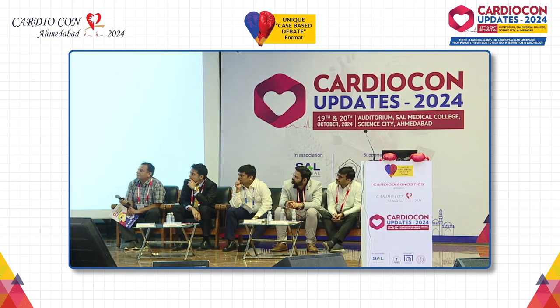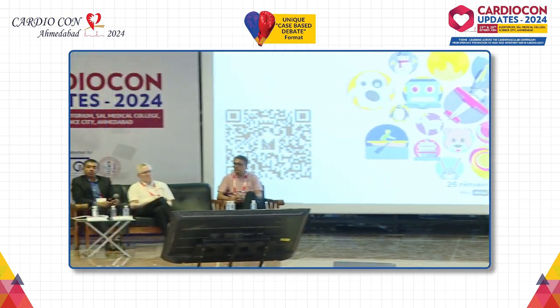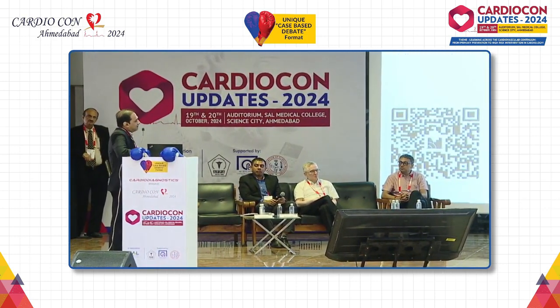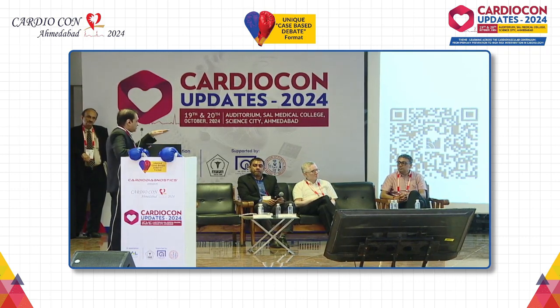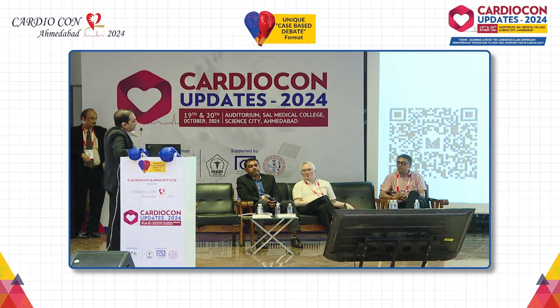I think there is a beautiful example, I saw it in one of the slides, where it is like breaking a mountain for the tunnel. So if you just want to chop off the top of the mountain, anything would do it. Rotational may carve it out like this. Mountain top will be chopped off by rota. But if you do IVL, you crack the mountain into small sub-mountains and then you slough it off. So then you have not only addressed the lumen, you've also addressed the part of the base of the mountain.